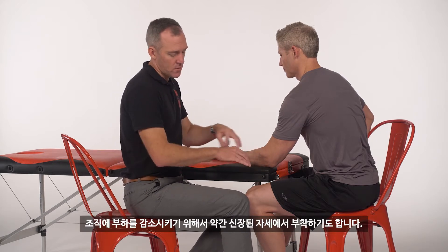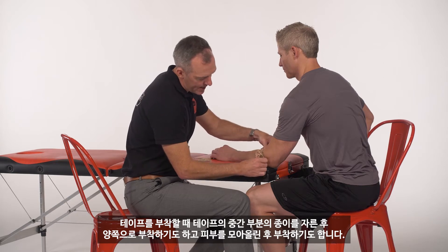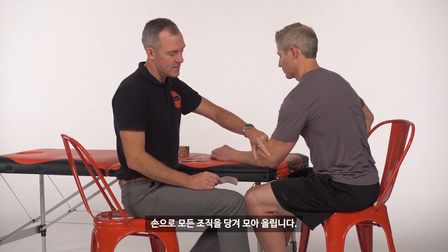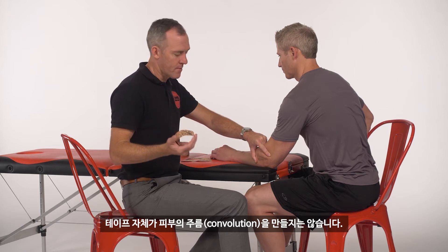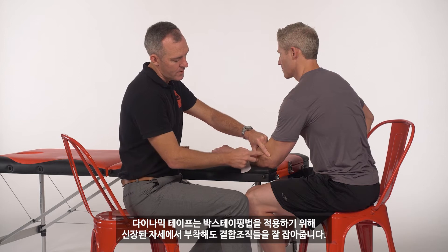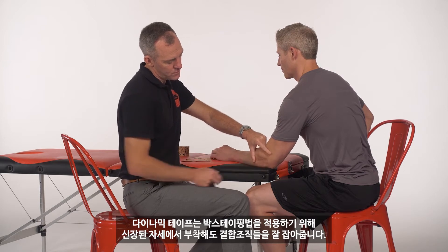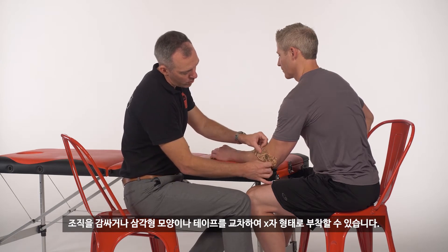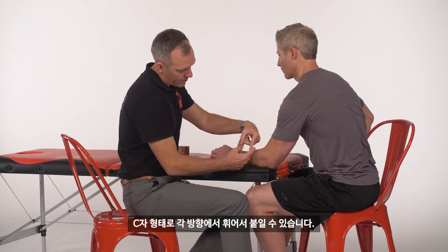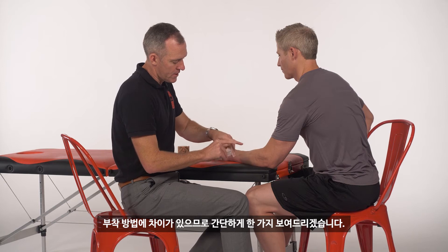With space creation type techniques you're often in a lengthened position or starting in the middle of the tape, sticking it down and using the tape to bunch up the skin. With this technique we're actually manually with our hands pulling everything together, bunching that up, and then sticking down and holding it there using the resistance of the tape. The tape itself doesn't have convolutions in it — it's nice and straight — and it's holding the soft tissue so even in the lengthened position we have deep boxing of the soft tissue. We can create shapes around things — a triangle, a cross or X, U's underneath, or C's and brackets on either side — there are many ways to do it.